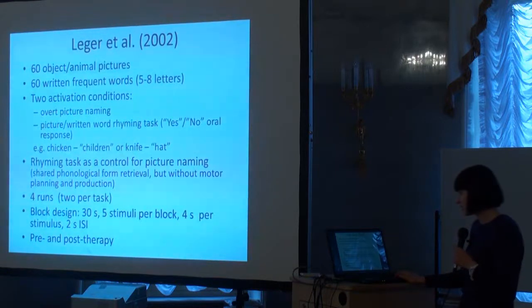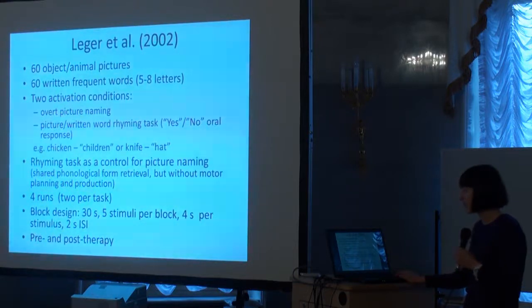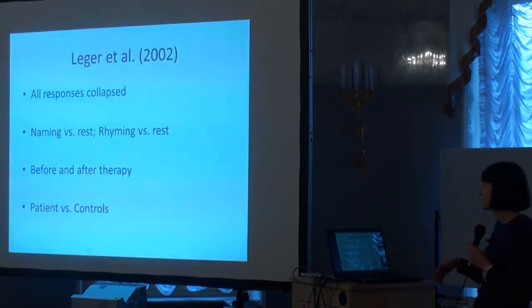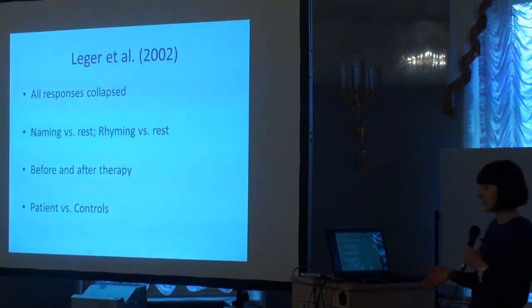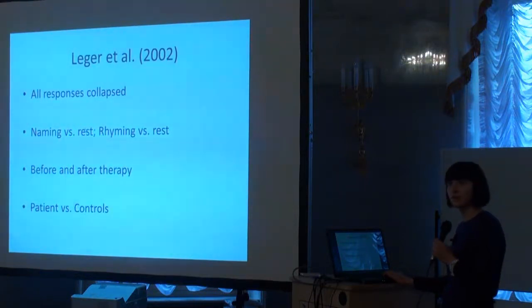Because this is an aphasia study, of course, they were interested in pre- and post-therapy effects. In the analysis, they collapsed all responses, because it is a block design and they couldn't differentiate the hemodynamic response to correct and incorrect trials. They contrasted naming to rest, where rest was doing nothing in their case, and the rhyming task to rest. Then they also contrasted naming to rhyming.